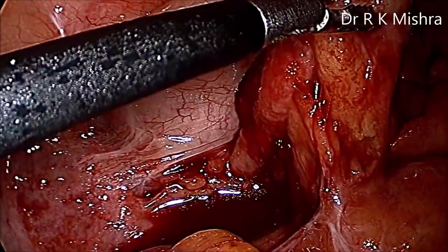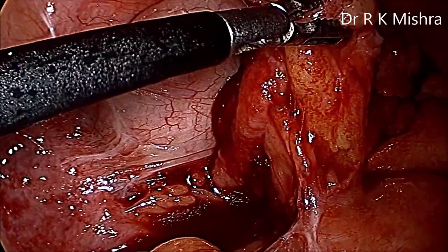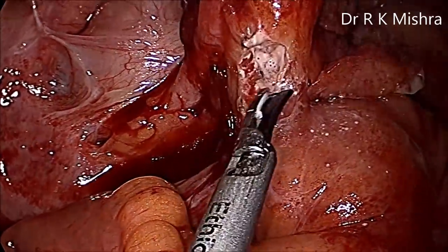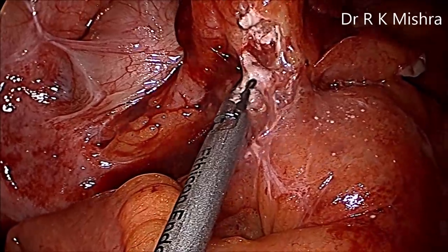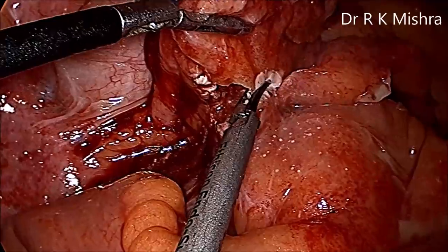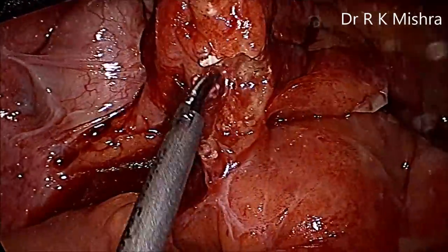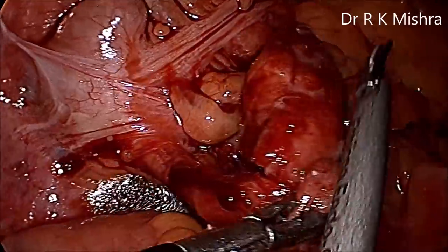So now anteromedial traction is given. And this is the harmonic scalpel, which is separating the mesoappendix. Harmonic, as you know, is one of the most advanced energy sources for appendicectomy, because it is not a current, it's an ultrasonic wave and a vibration. So it's a harmonic vibration, so it doesn't create direct coupling, capacitive coupling or insulation failure. And you can easily separate it.